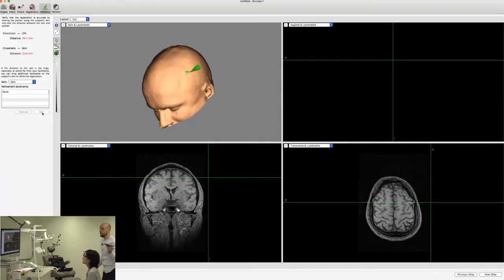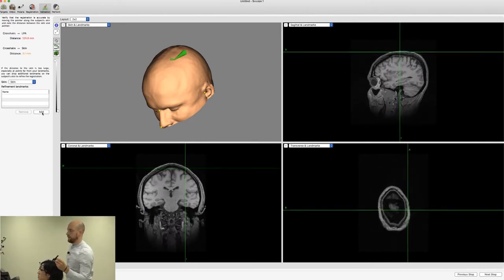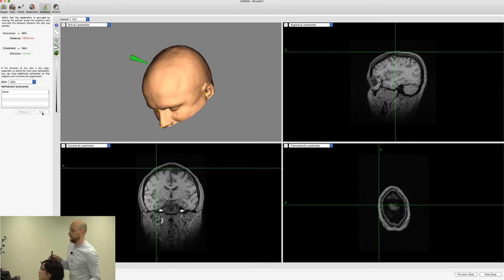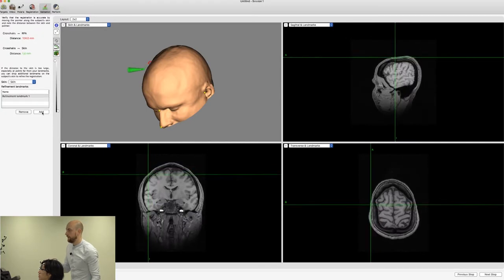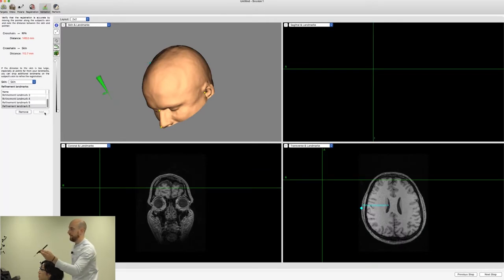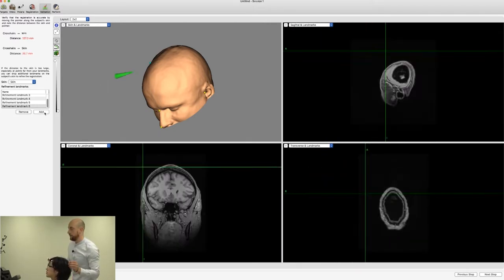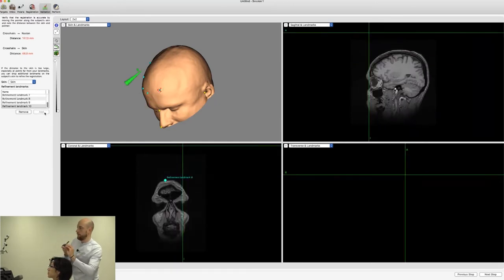Okay, so is my foot switch going to work this time? Okay, so we're on the top of the head there. So we want to move that round. Sorry, so the field of vision here is. So if I could have someone to click on the mouse again, that's it. If you just keep clicking, just click away, that's good. And BrainSight is going to work out where the pointer is. Bear with me. Okay, so if we can bring the chair around slightly. That's it. Yeah, so we go across the front of the head. And then I'll just move this.